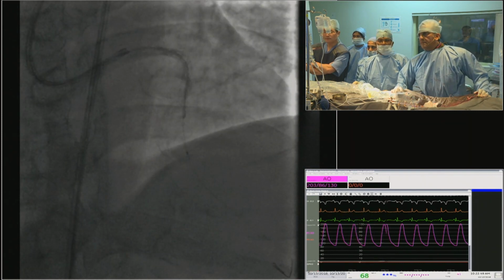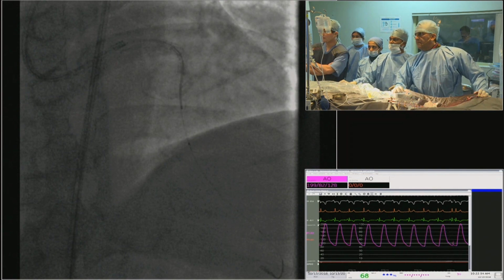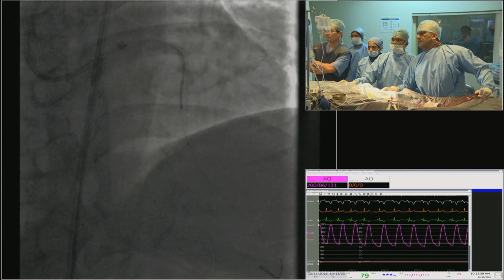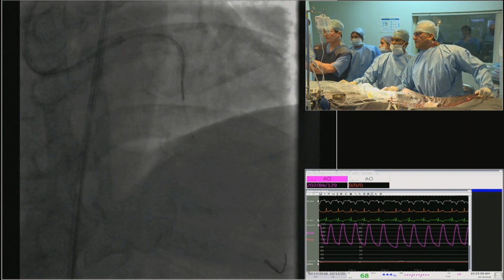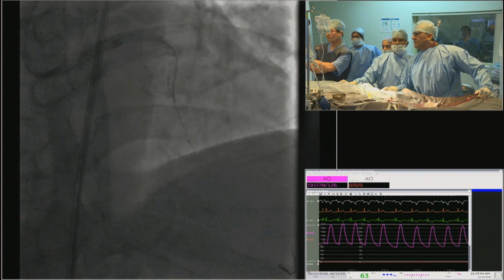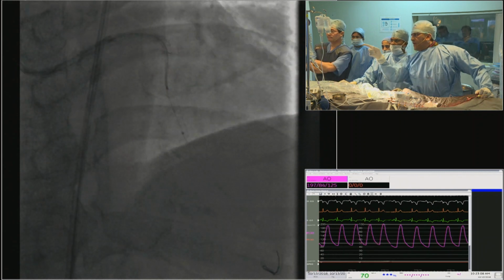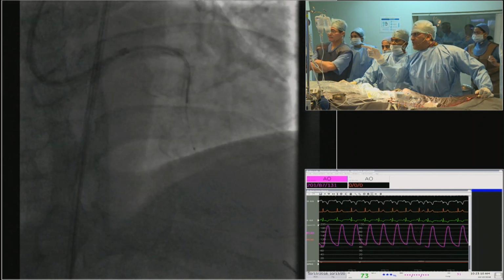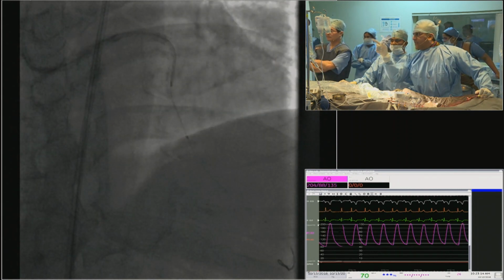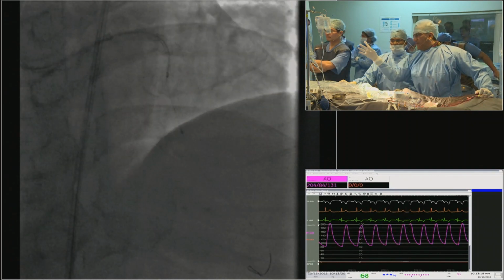The only thing I would like to convey to many of the younger generation of cardiologists is this: Kirti is doing a great demonstration of a step-by-step technique, and will actually show you what happens at low pressures and perhaps what happens at the real pressures that you would deploy it. Look at that. See, that stent merges with the distal lumen, and that is what I want. I do not want to traumatize the distal edge. But we can't see it. I just saw it, but we'll show it to you again.